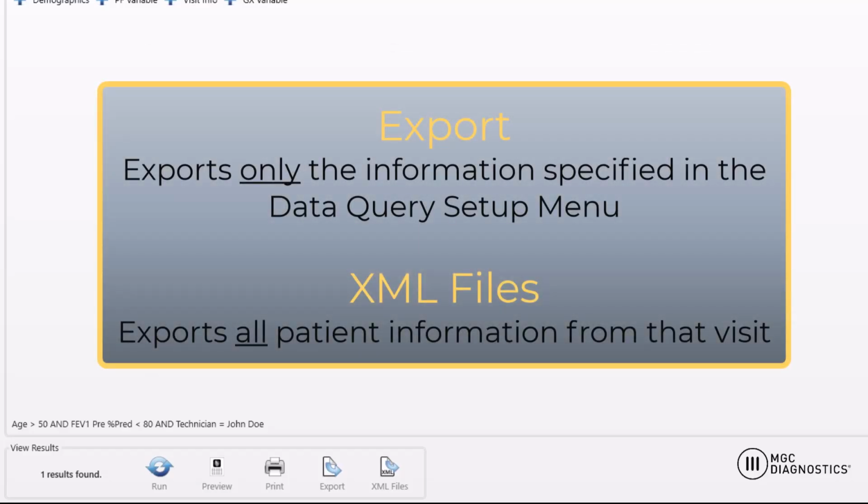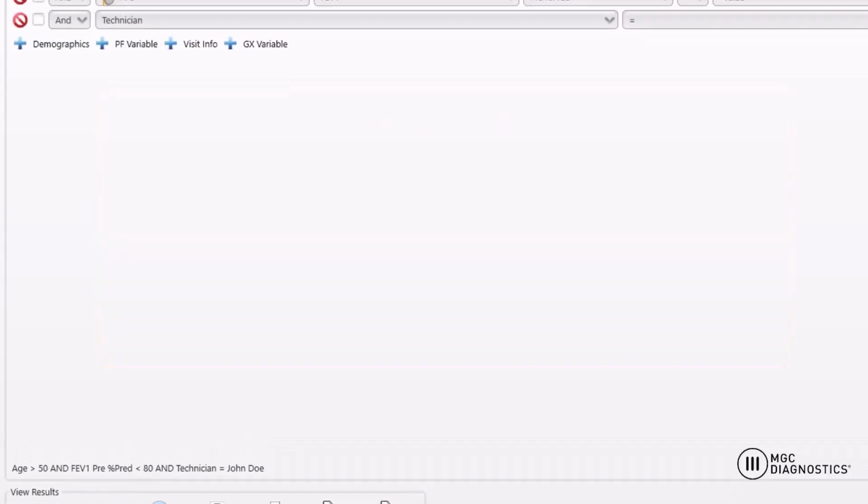Note, there are significant differences in the two export options. The exported CSV file will contain only the data you specified in the Query Setup menu. However, the exported XML file will contain all visit and test information from that visit for each patient.